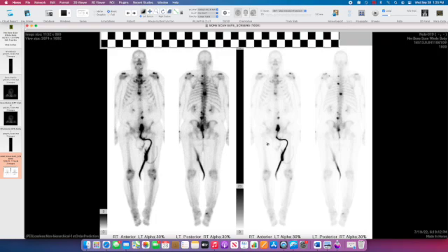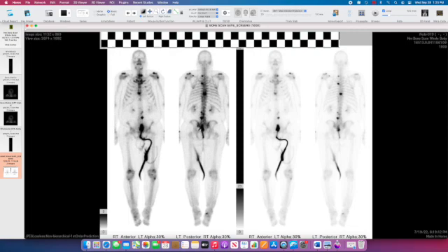In this case we do see multiple abnormal foci of intense radiotracer uptake: here in the lower cervical spine posteriorly, mid thoracic spine, lower thoracic spine, and several in the lumbar spine — approximately L2 and L4. If you look closely at the sacroiliac joints, some uptake is normal but they should be symmetric, and I see an additional focus here in the left sacroiliac region.